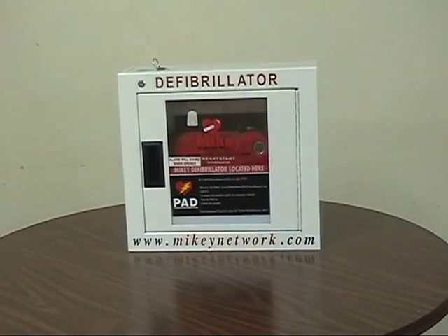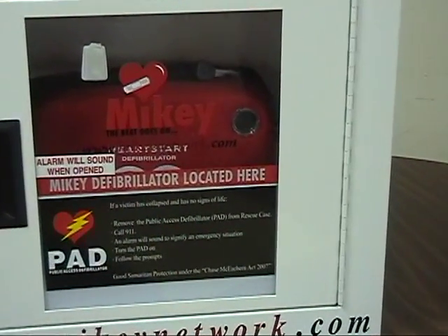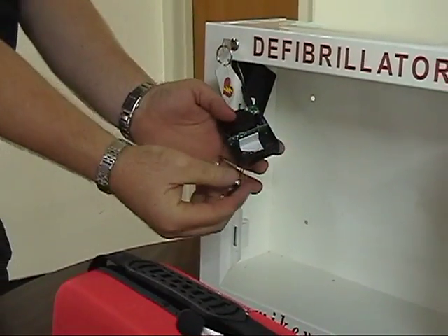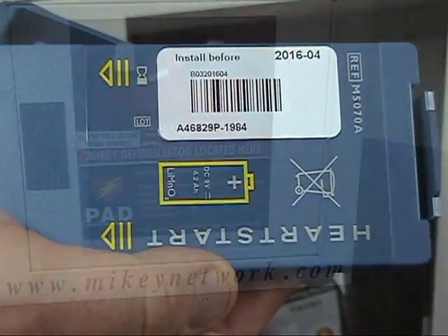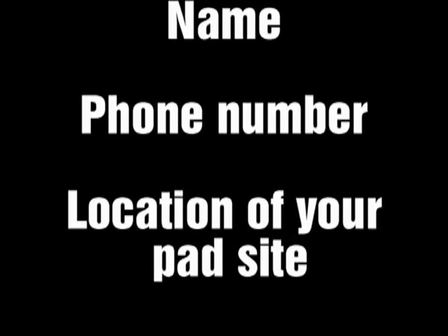At this point, the six-month inventory check is completed. To perform the monthly checks, simply look at the public access defibrillator and ensure the operational or status light is blinking green. If a problem is found with your PAD — for example, expiring electrodes, batteries expiring, or the PAD is not blinking green — simply call EMS at 1-866-856-3248. Tell the answering service your name, your phone number, and the location of your PAD site. Somebody will call you within about 15 minutes and help you to solve the problem.